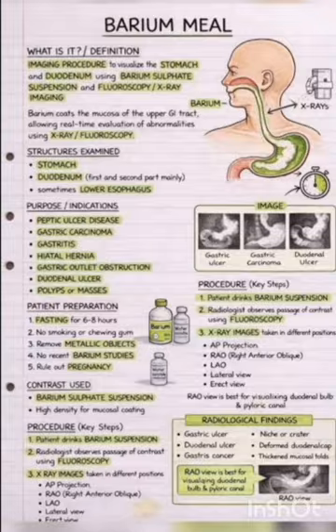Then move into double contrast study. For double contrast study, the patient is placed in an upright position, then a hypotonic agent, Buscopan or glucagon, is given to the patient to suspend peristaltic movement. Afterward, 100 ml of high density barium sulfate with effervescent powder, a gas producing agent, is given to the patient and the patient is asked to swallow. The patient is told not to burp after swallowing.